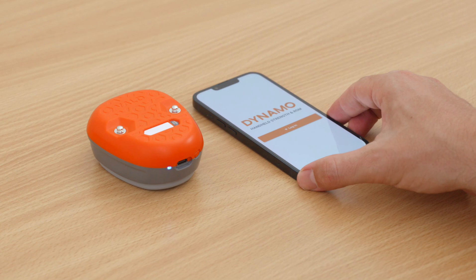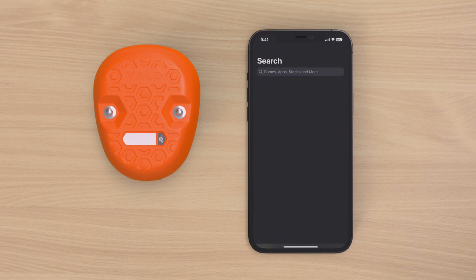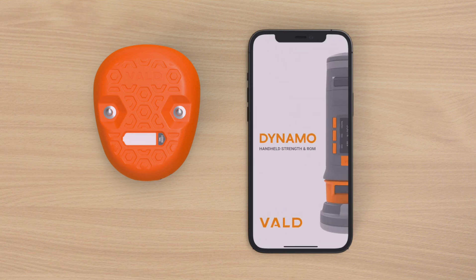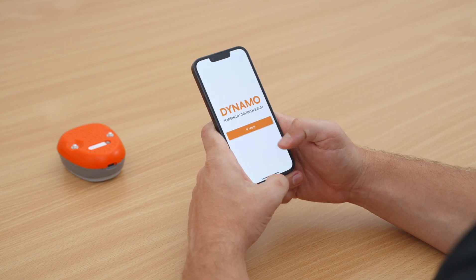To unlock the true power of your Dynamo Lite, search for and download the Dynamo mobile app on your smartphone from the Apple App Store or Google Play Store. Open the Dynamo app and enter your VALDE login details.